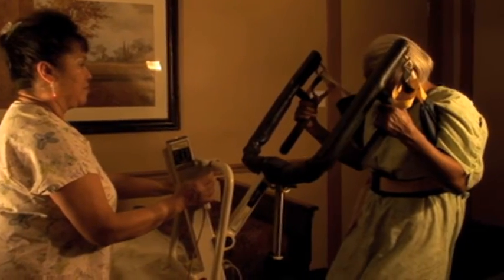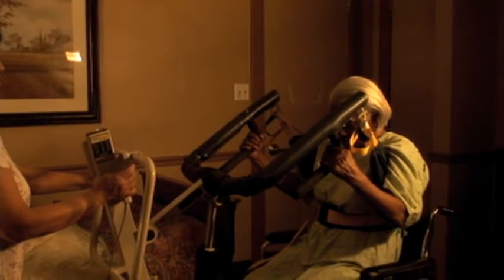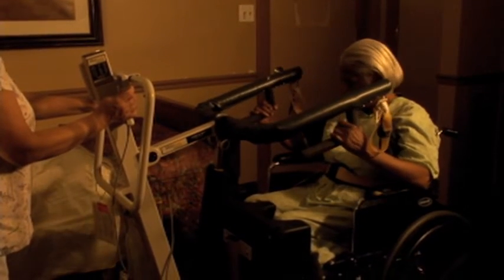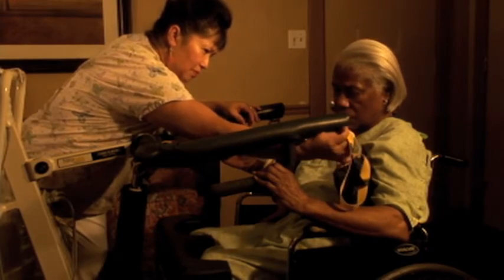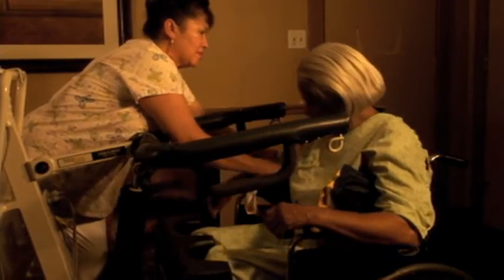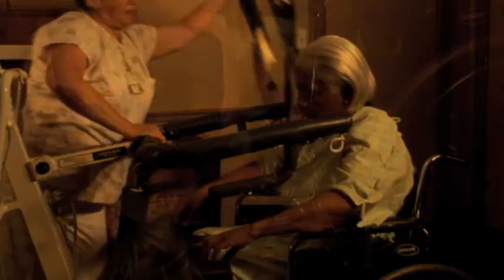Finally, lock the wheels of the lift and position the resident directly over the target transfer area. Slowly lower the resident. Once the resident is completely lowered, take the belt off and remove the lift from the area.